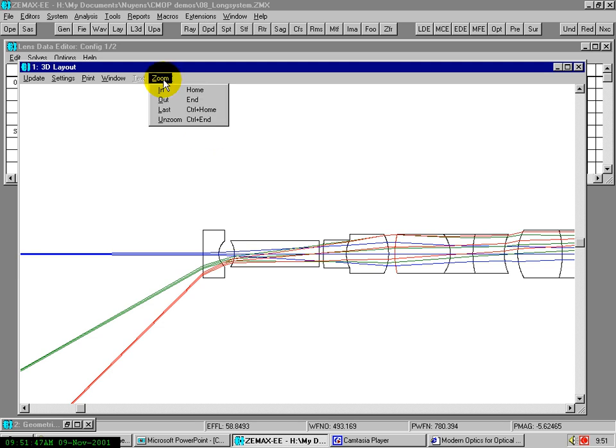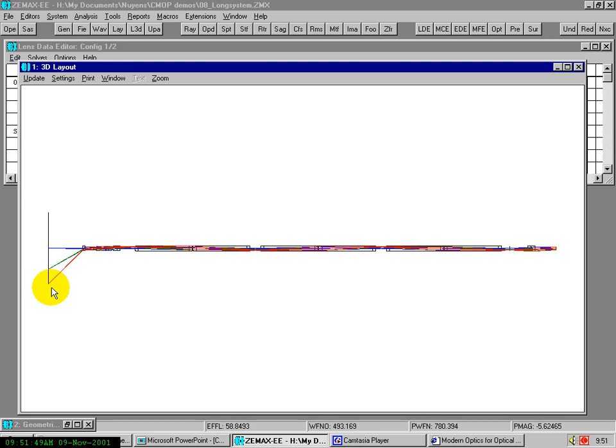Okay, this is an example of a very long system. This is a medical endoscope, which is used to look inside the body.